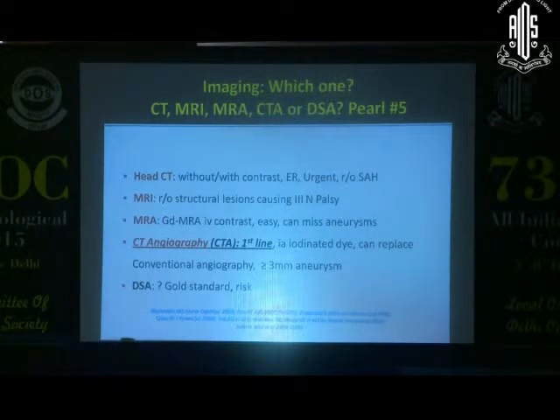So the next question comes, if one has to do imaging, which is the best modality? Well, in choosing the best modality, this is a slightly tricky question, CT angiography versus MR angiography. Having said that, gold standard is the catheter angiogram, which is the digital subtraction angiogram, which gives you an unparalleled diagnosis, not only to diagnose, but also to intervene and actually coil the aneurysm also.